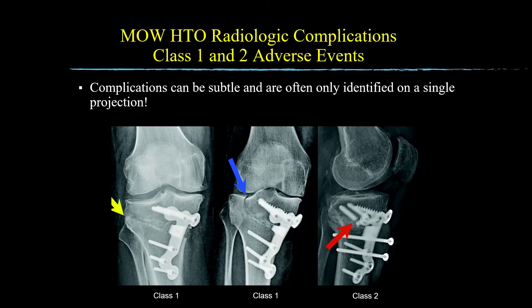Fractures and hardware failure can be easily overlooked on post-op images. The radiograph on the left shows an example of a class 1 adverse event manifested by a non-displaced hinge fracture through the lateral tibial cortex at the margin of the osteotomy, as shown by the yellow arrow. A hinge fracture is an extension of the osteotomy plane through the lateral tibial cortex. The middle radiograph also shows a class 1 adverse event manifested by a minimally displaced tibial plateau fracture, indicated by the blue arrow extending proximally from the osteotomy plane; the patient was asymptomatic and did not require additional treatment. The image on your right is a lateral knee radiograph illustrating a class 2 adverse event demonstrating a single fractured screw shown by the red arrow; the patient needed to continue protected weight bearing for longer than the usual six weeks.